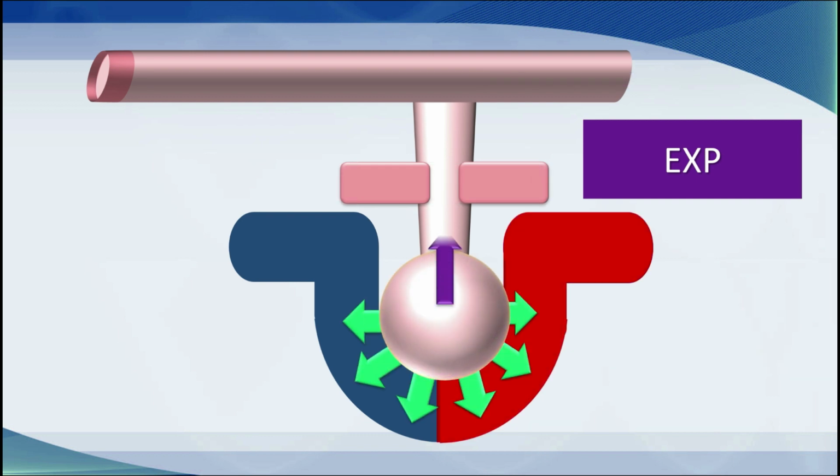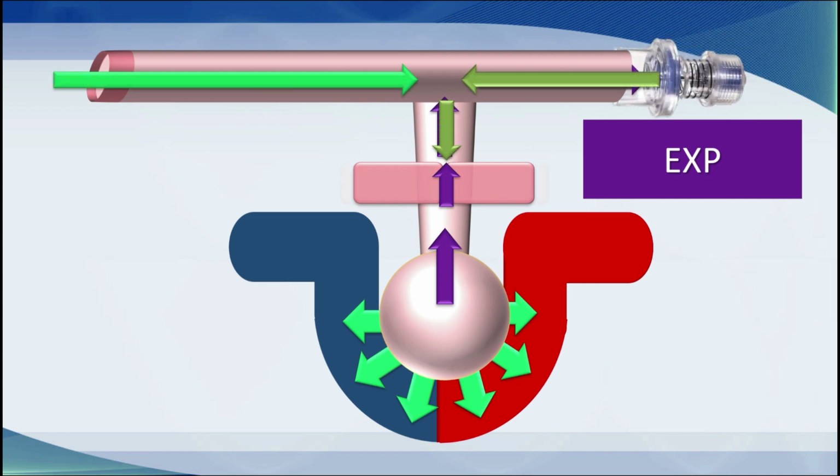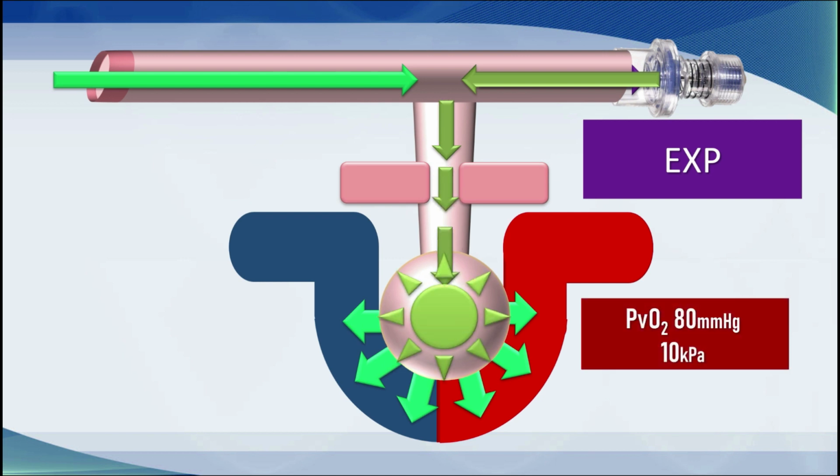Now what we're going to do is we're going to come along here and treat this patient with PEEP or CPAP. So we're going to apply a PEEP valve and a positive pressure at end expiration, and what's going to happen here is we're going to splint open those closed lung units during expiration. So you can see what's happened here. The airway closure that had happened previously can't happen because the pressure that's being backfilled from PEEP into the airways is higher than the pressure that's closing the lung units and stents them open, and as a result there is less venous admixture in expiration.